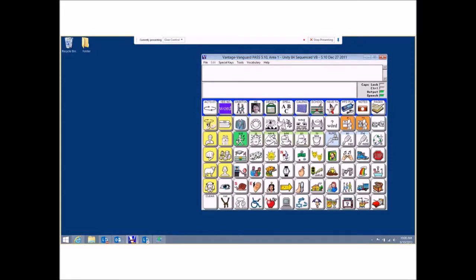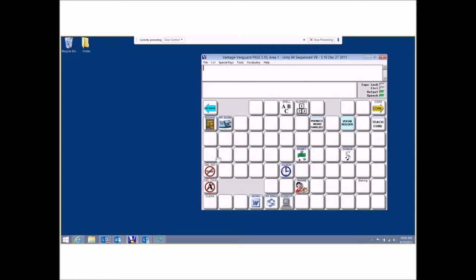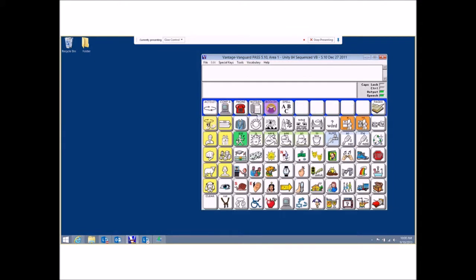If it doesn't, he'll know how to fix it, but just in case, let's say it looks like this when he starts, there should always be a button in the activity row that says core that would take you right back. If the activity row doesn't look the way you expect, with Jake's little smiling face on there, you'll just click on activity until it does return to that. And there you'll see Jake's smiling little face standing in front of a tree, and you'll always know that that's where you start. What I'm using is just an emulator on my computer, but this is an exact replica of what Jake sees on his device.